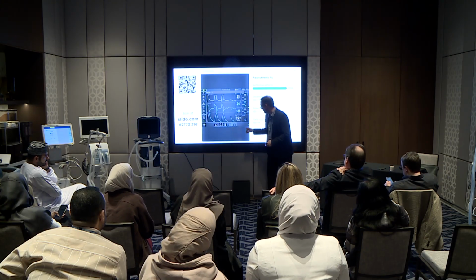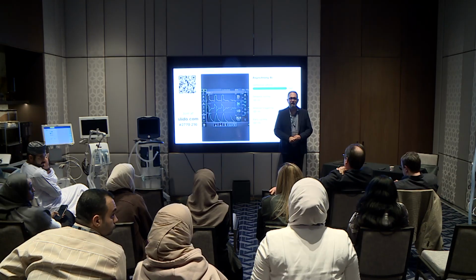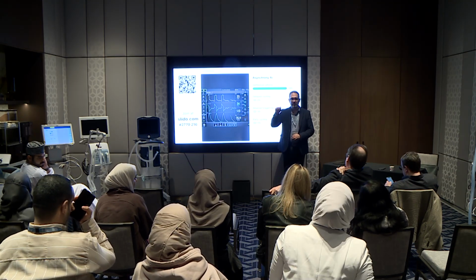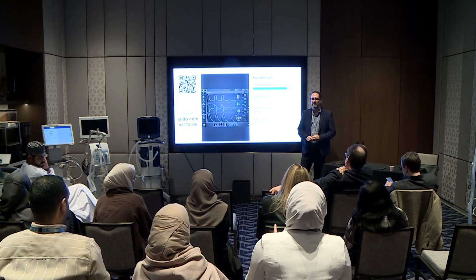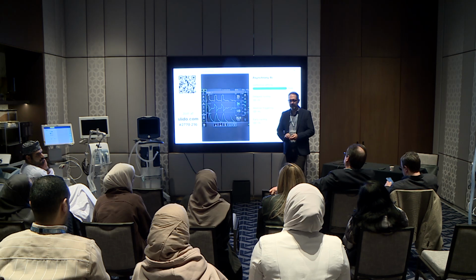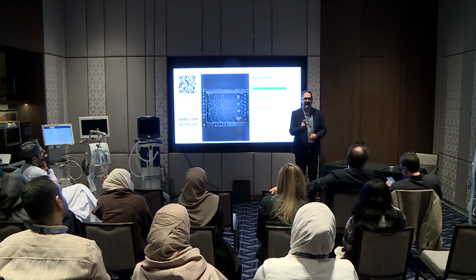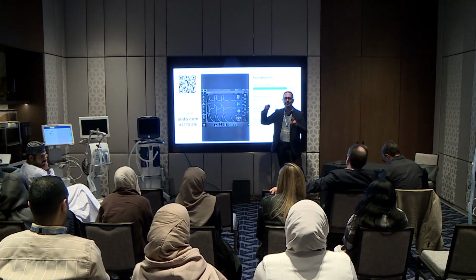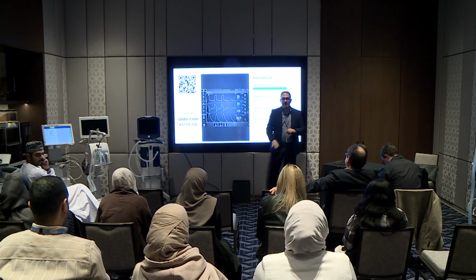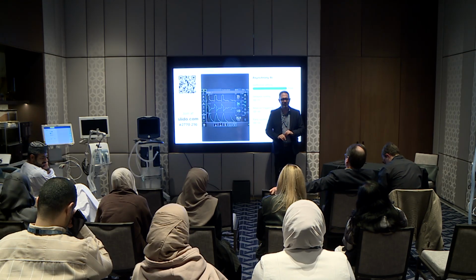It's not on the screen here, but if you hit this button here, you have what's called inspiratory cycle. It was actually on one of the other screens, 10%. I had it earlier on, where the patient was at 60%. You can control how high this goes up. Many people feel the patient decides when they cycle off in pressure support. That's not the case.